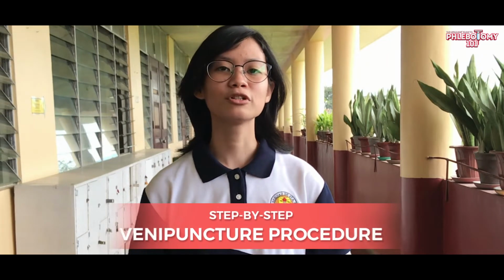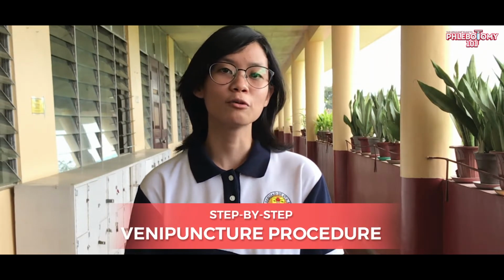Guide to Phlebotomy 101. As students ourselves, alam namin na mas madaling maintindihan ang laboratory practices kapag nakikita ang actual presentation. We prepared the step-by-step Venipuncture demonstration video in hopes na makakatulong ito sa face-to-face classes and internship natin. Tara, simulan na natin!